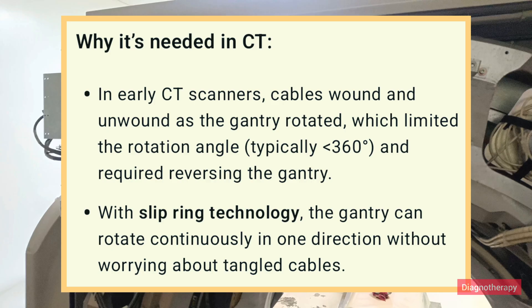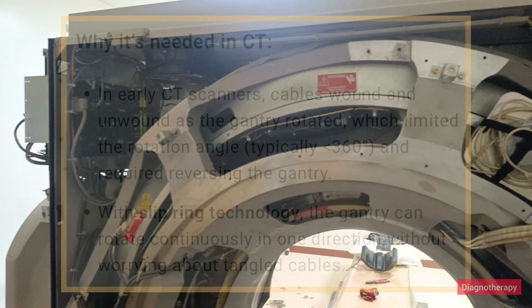In earlier CT scanners, cables wound and unwound as the gantry rotated, which limited the rotation angle — typically less than 360 degrees — and required reversing the gantry. With slip ring technology, the gantry can rotate continuously in one direction without worrying about tangled cables.